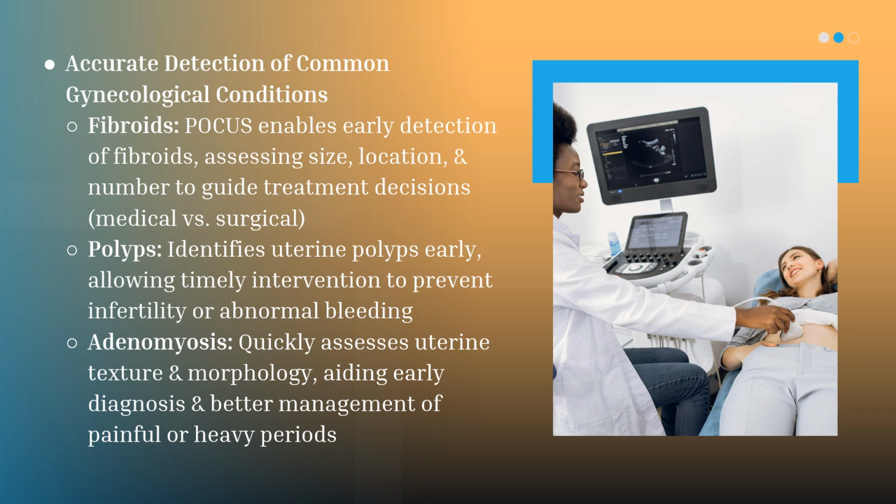So you want early detection of fibroids and to accurately get the size, location, and number, so that even if you're a nurse midwife or nurse practitioner and you're not the one going to manage the fibroid long-term or discuss removing it, you're going to be part of the initial stage to give the most accurate information to the obstetrician, the person that's going to continue the care.